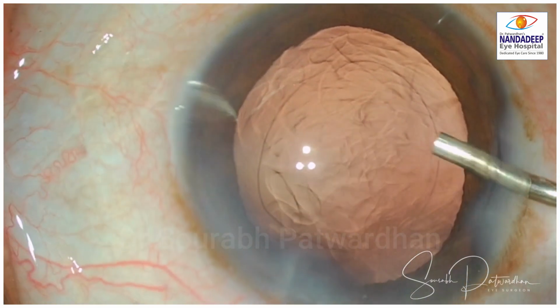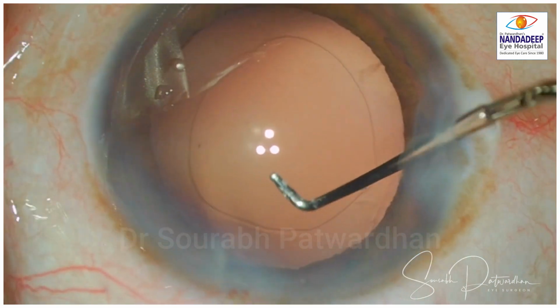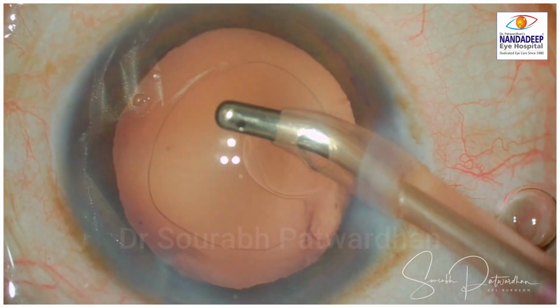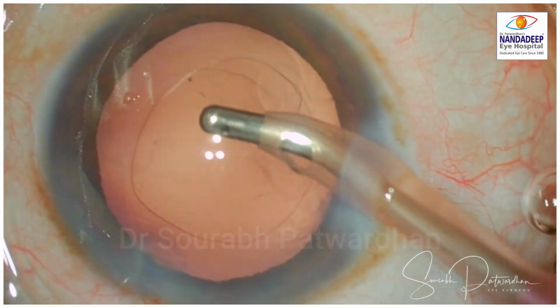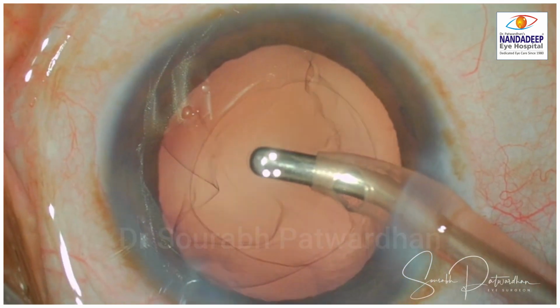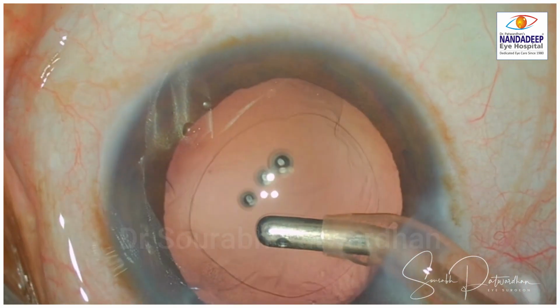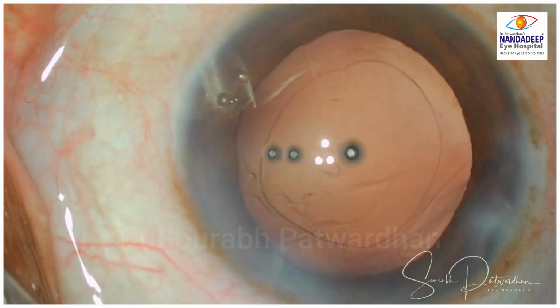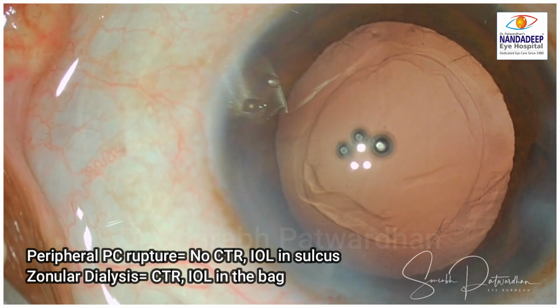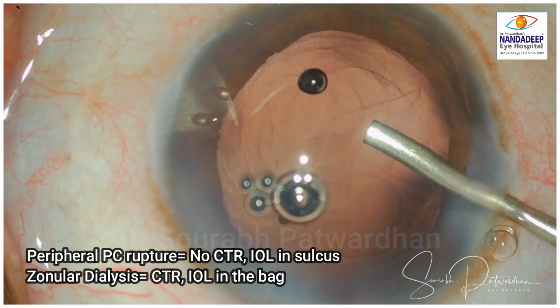So how to tackle this issue? Once we inject the OVD, you find that the bag appears normal. I try to judge whether the posterior capsule is folding back. It doesn't. So what I do is I remove some amount of OVD because I want to be sure whether it's just the posterior capsular dialysis or posterior zonular dialysis, or if there is a peripheral PC rent, because the management is totally different. If there is a PC rent, I am not going to put a CTR. I will be placing the IOL in the sulcus. But if it is just posterior zonular dialysis, I can put a CTR.